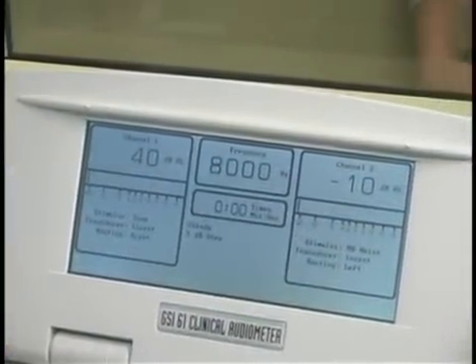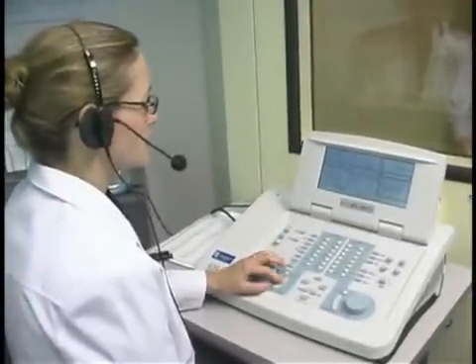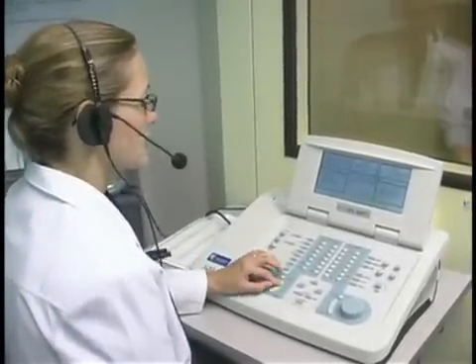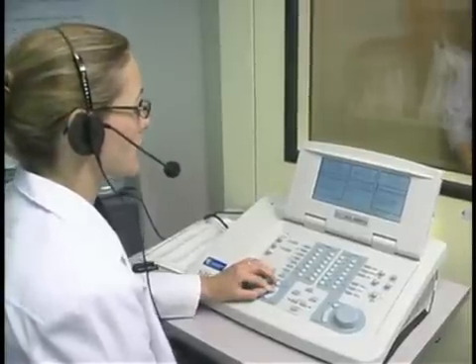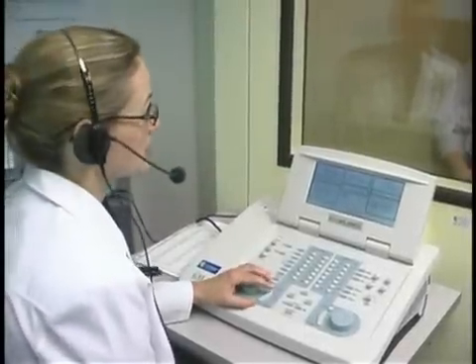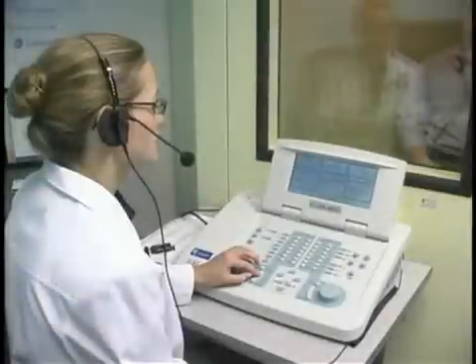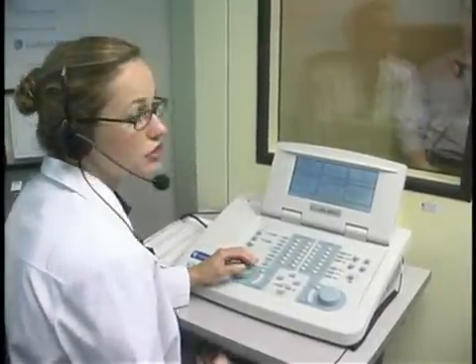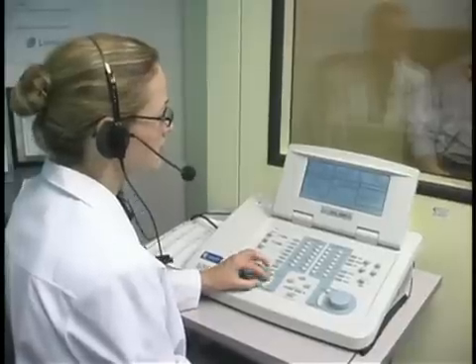He's got excellent hearing. What we're measuring is the level of the frequency in a unit we refer to as decibels hearing level, or dB HL. That's referenced to audiologically normal young adults — so zero dB HL doesn't mean there's no sound; it represents the average hearing sensitivity of otologically normal young adults sampled to generate this measure. For adults, we say that a result of 25 dB HL or better — 25 dB HL or less — is the normal range of hearing. For children, we're a little more stringent because they're learning language, and it's really critical that they hear those very soft consonants and sounds that occur in speech clearly in order to learn speech properly.